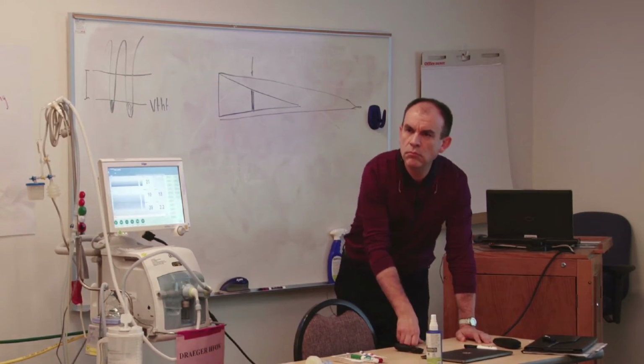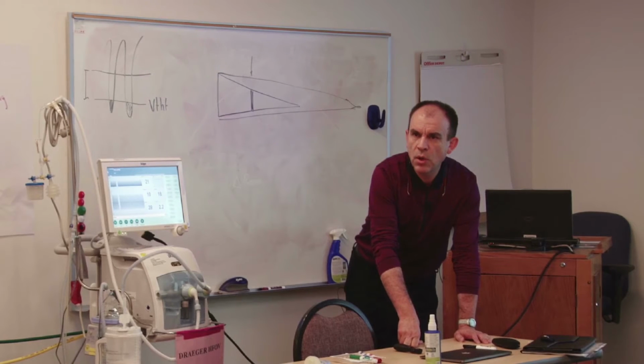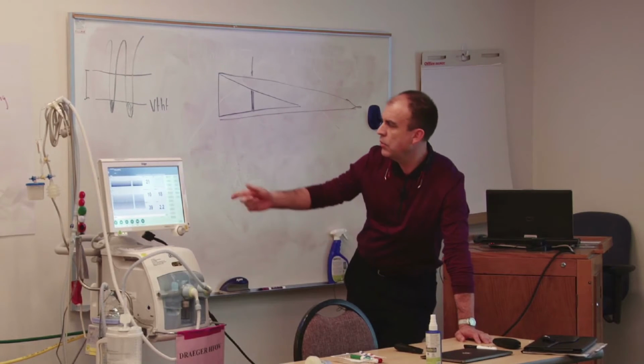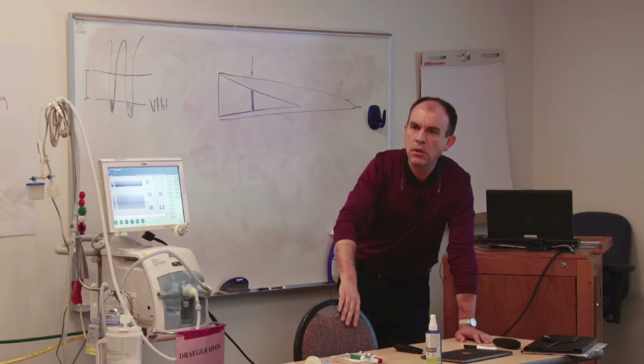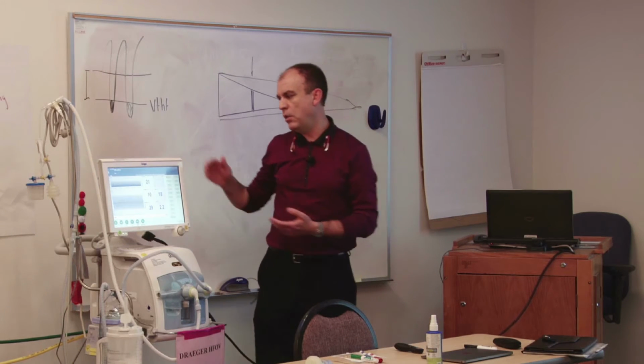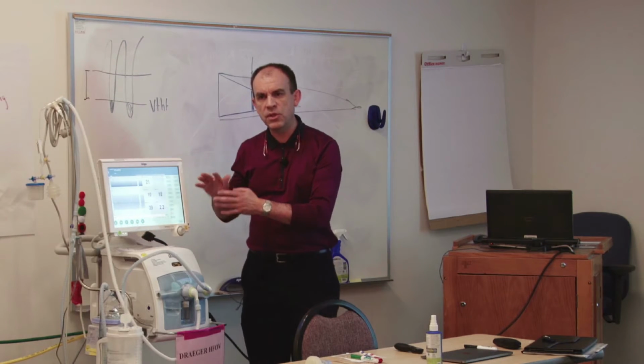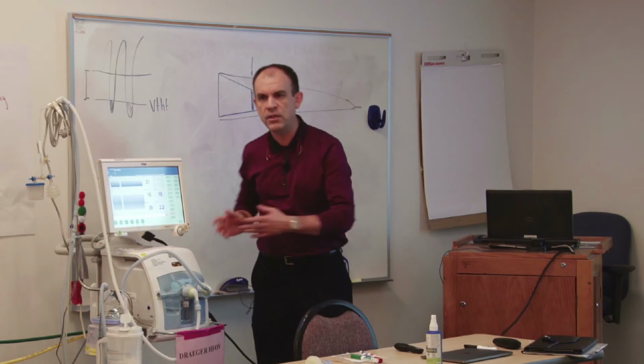But do you all extubate from the oscillator? Sometimes, not always. Depends on the baby. Most times we try to switch to conventional. But the advantage is that you're going to use the ventilator only as high frequency, so you're still going to have to shift from one ventilator to the other.